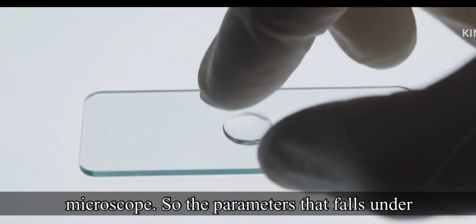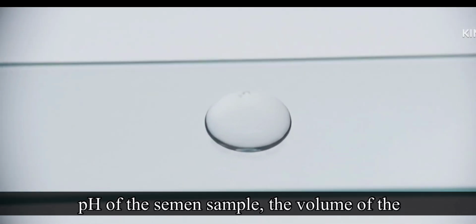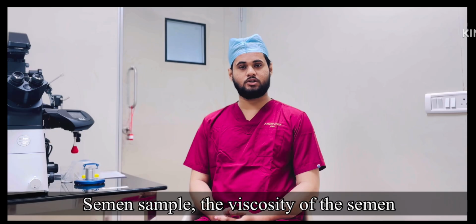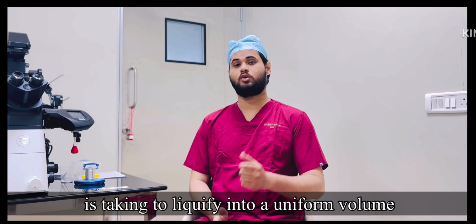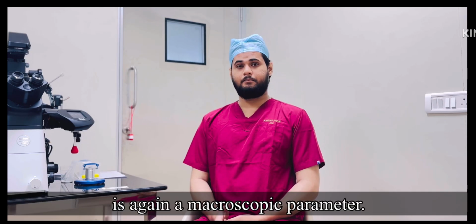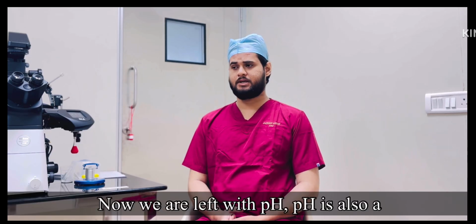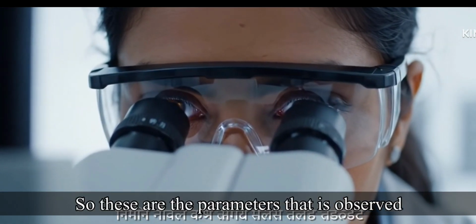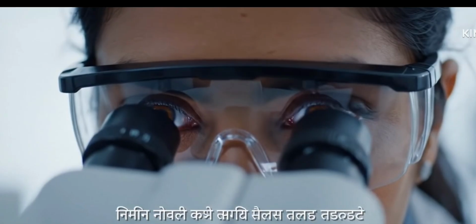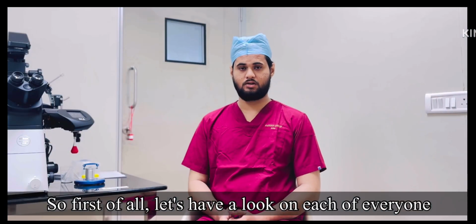The parameters that fall under the macroscopic parameters are the pH of the semen sample, the volume of the semen sample, the viscosity of the semen sample, and the liquefaction time that semen takes to liquefy into a uniform volume. pH is also a macroscopic parameter. So these are the parameters that are observed in a semen sample. First of all, let's have a look at each one by one.